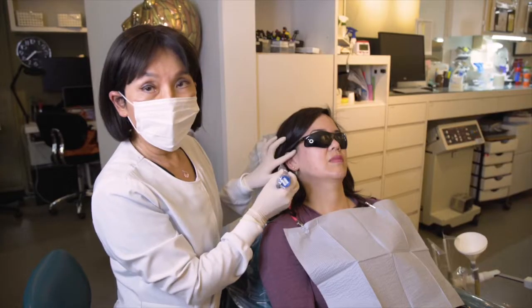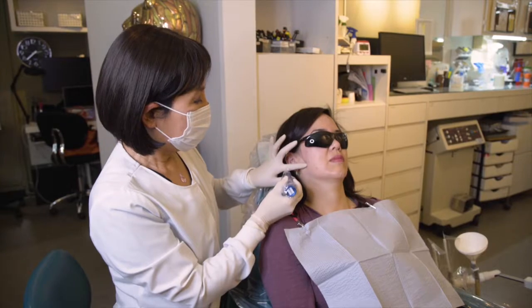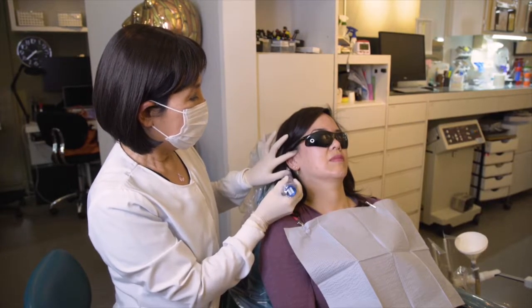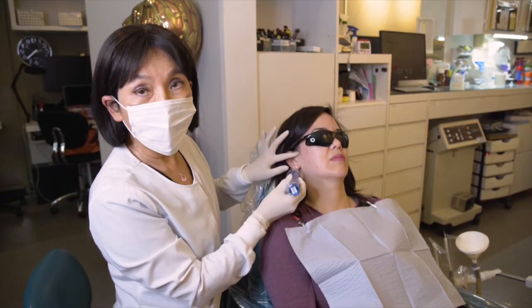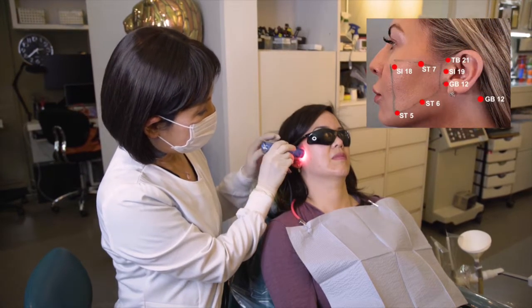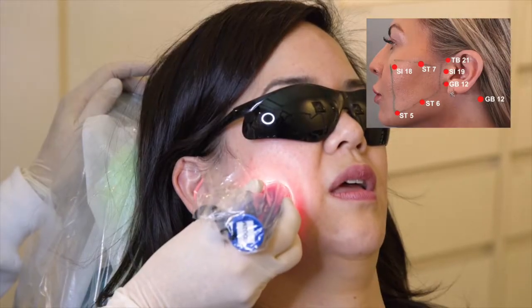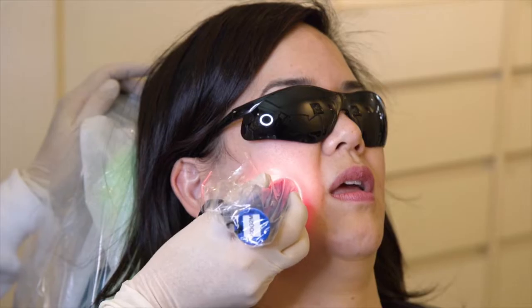If TMJ symptoms do exist, we will also do the palpation to know which side needs to be treated more. Usually it's the middle part, and I will instruct the patient to open their mouth a tiny bit so that the light energy can get in there better.